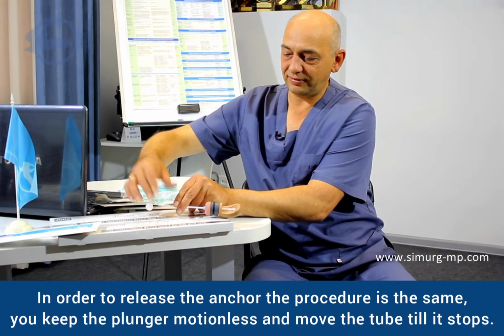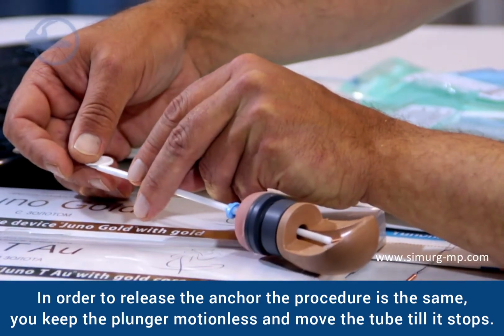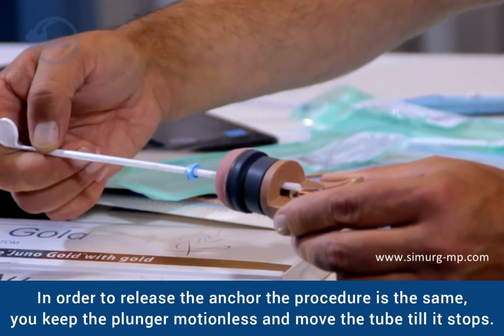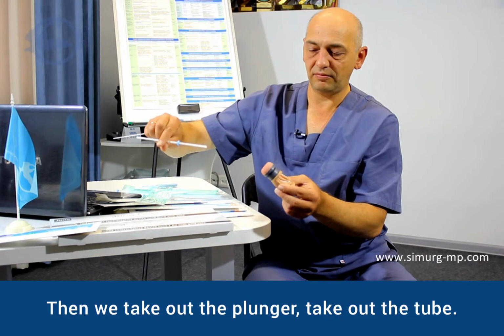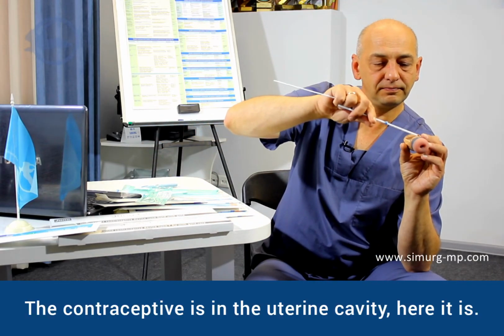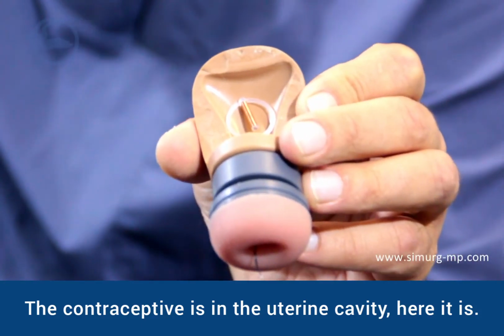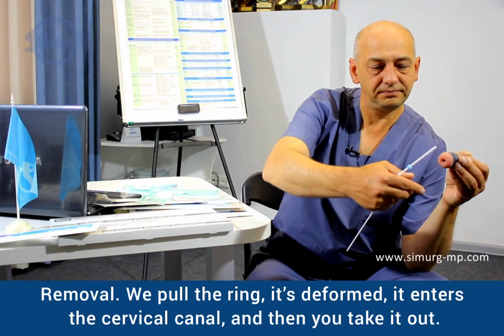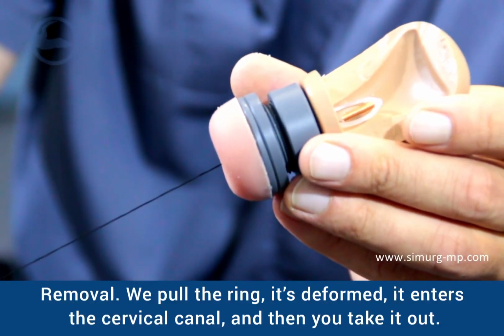In order to release the anchor, the procedure is the same. You keep the plunger motionless and move the tube till it stops. Then we take out the plunger, take out the tube. The contraceptive is in the uterine cavity. Here it is. Removal. We pull the ring, it's deformed, it enters the cervical canal, and then you take it out.